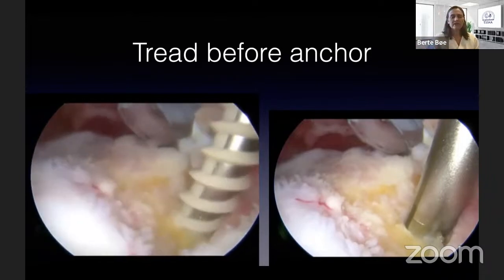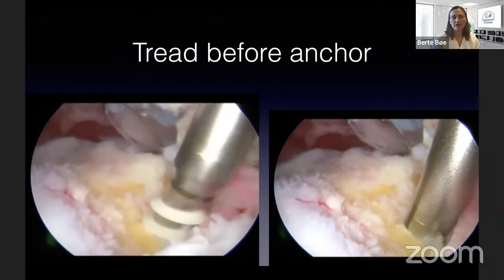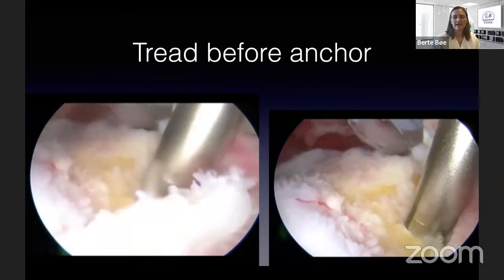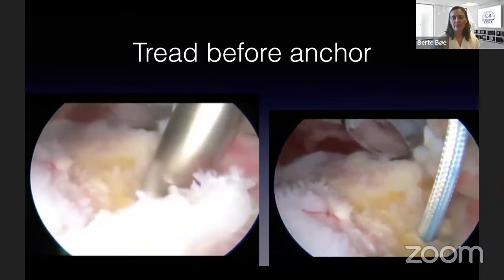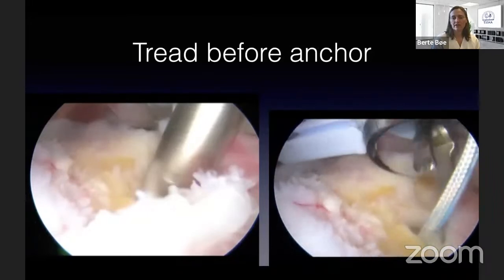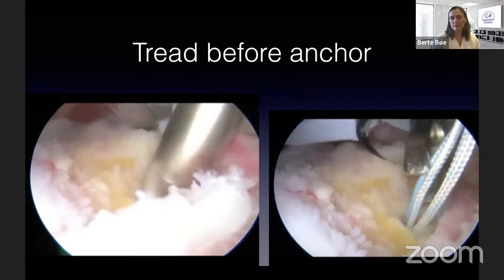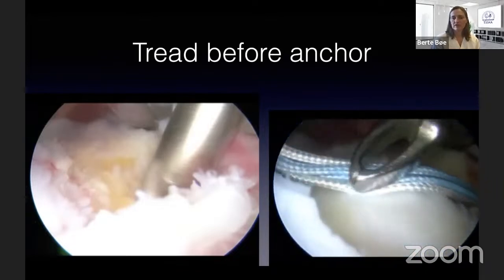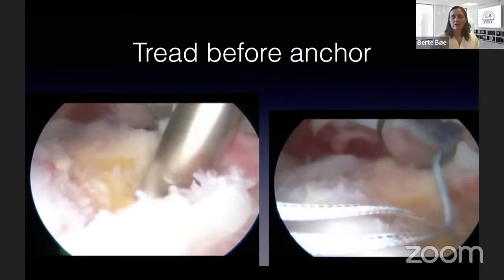And I know that many surgeons use needles or awls to make microfractures in the footprint to improve the healing of the cuff. These anchors are threaded and so the good stuff from the bone marrow is supposed to come out from the anchor. But of course, if you have a situation where you doubt the healing, you can add some more holes to get bleeding in the footprint.